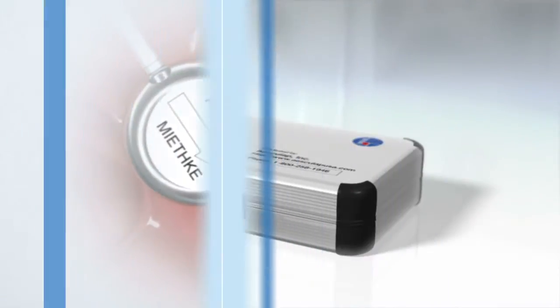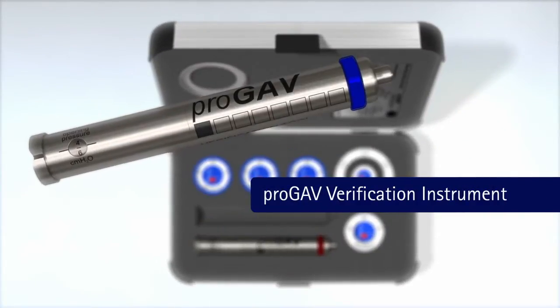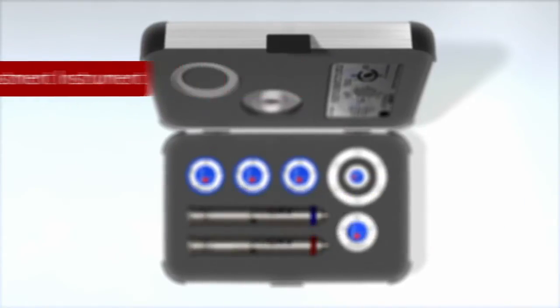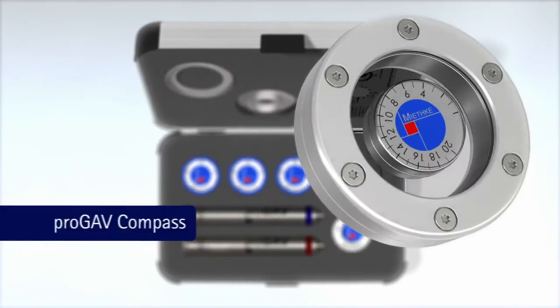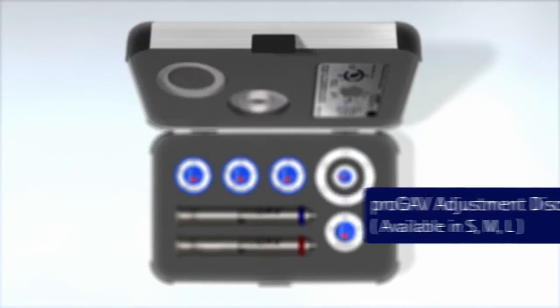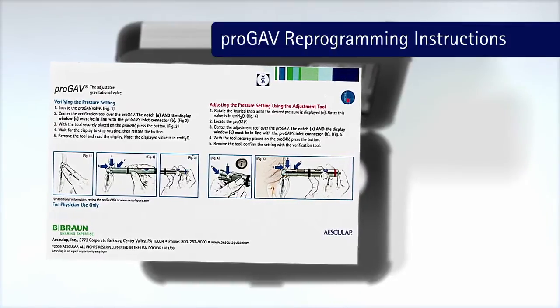The ProGav system comes with the following tools for adjustment and verification: the ProGav Verification Instrument, the ProGav Adjustment Instrument, the ProGav Master Disc, the ProGav Compass, the ProGav Adjustment Discs, the ProGav X-Ray Template, and the ProGav Reprogramming Instructions.